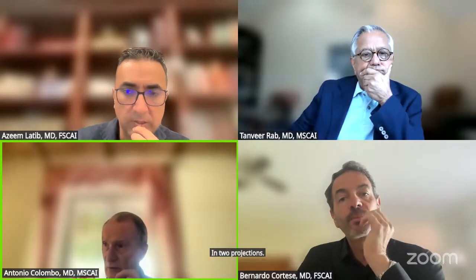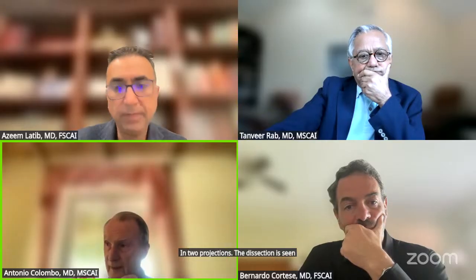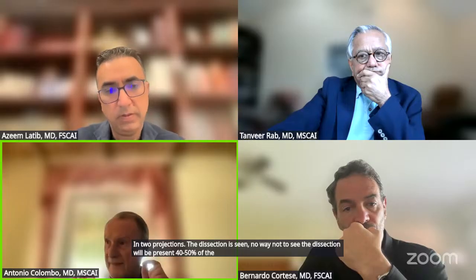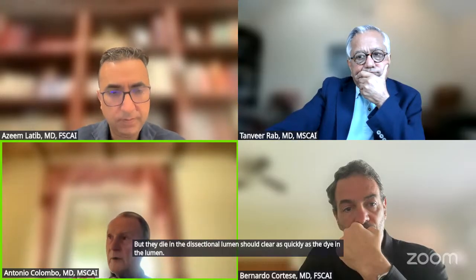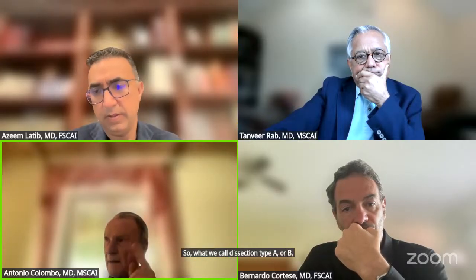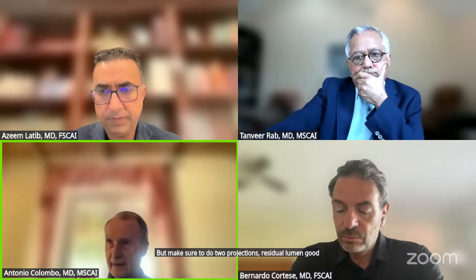The dissection is seen, no way not to see the dissection, it will be present 40, 50% of the time, but the dye in the dissection lumen should clear as quickly as the dye in the lumen. So what we call dissection type A or B and some type C, but make sure to do two projections, residual lumen good and good dye clearing.